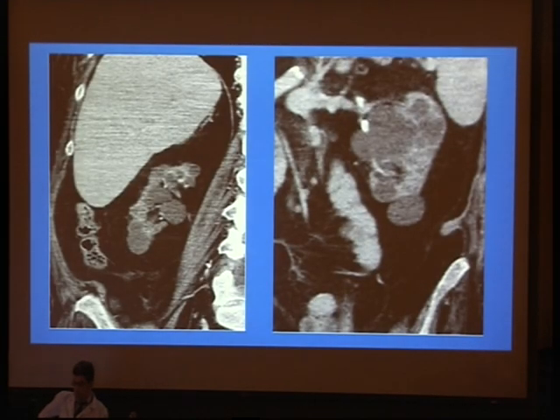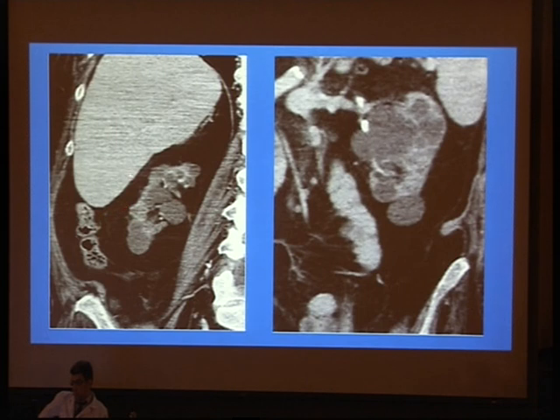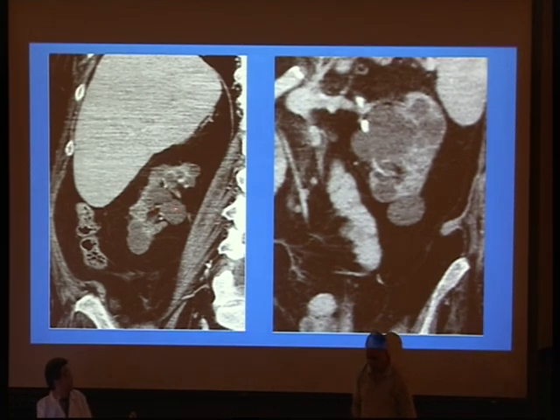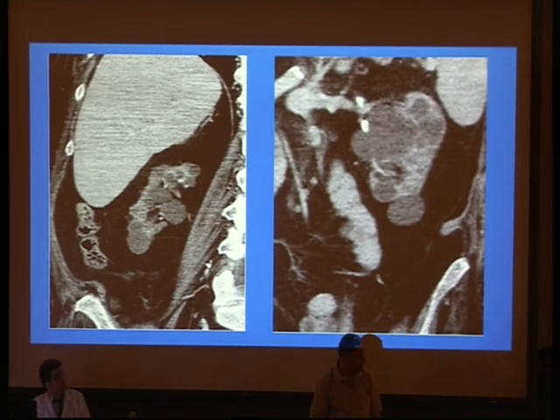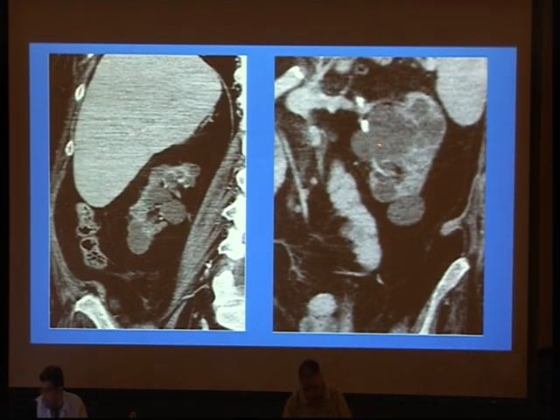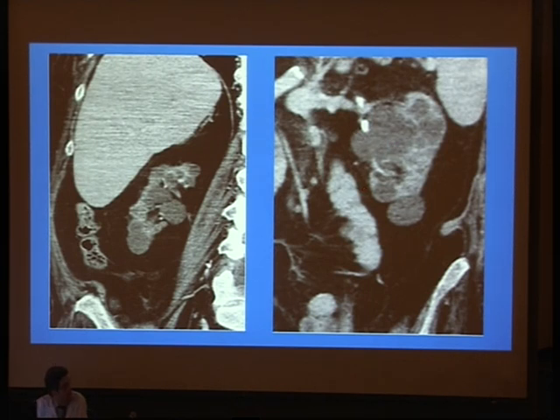An example at CT without contrast: I can diagnose this patient with chronic renal impairment — a small-sized kidney with irregular contour and multiple cysts acquired during long-term hemodialysis. Also, this coronal CT shows multiple cyst development in the kidney during the course of hemodialysis.